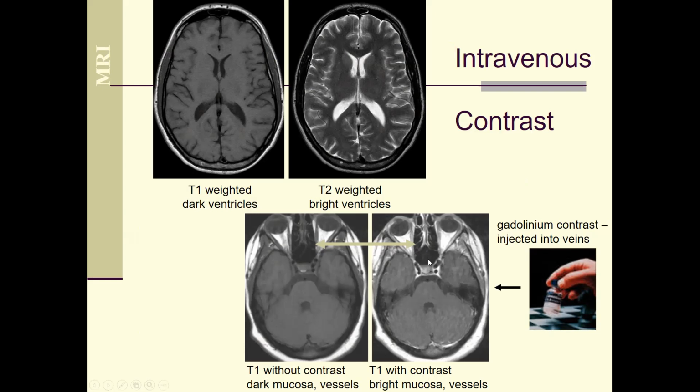A similar effect you can see in more hypervascular content in the brain tissue, which can change in color if you give contrast. The same thing happens with malignant tumors or some of the tumors that are very hypervascular, which can get enhancement. So that helps you to detect metastasis, or detect recurrent tumors, for example.